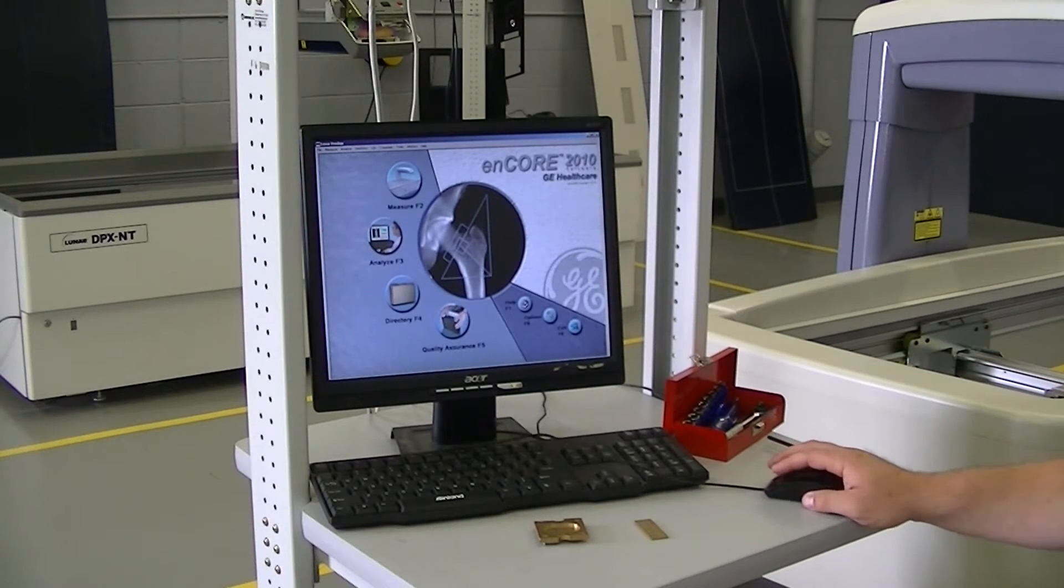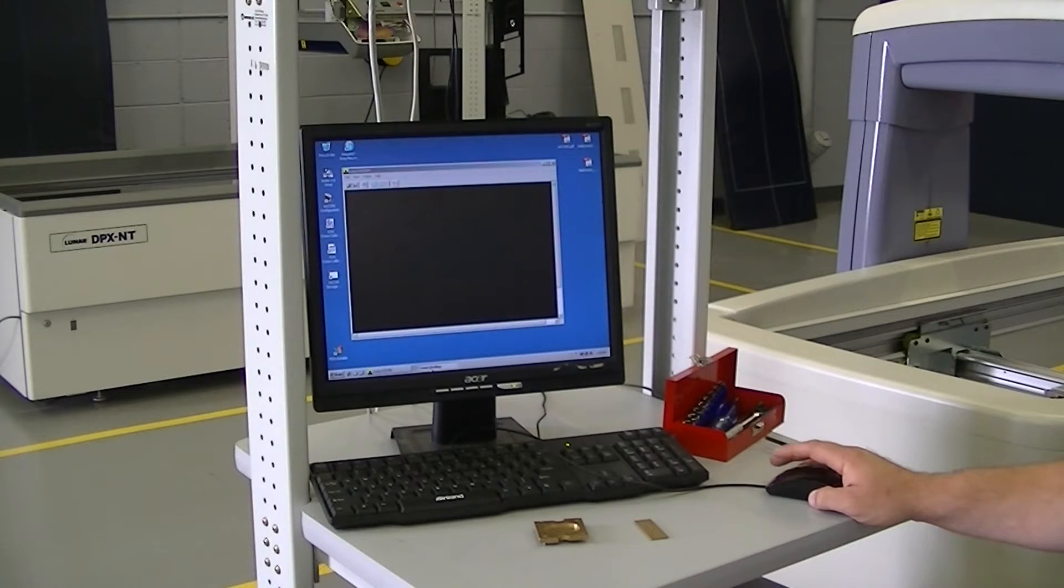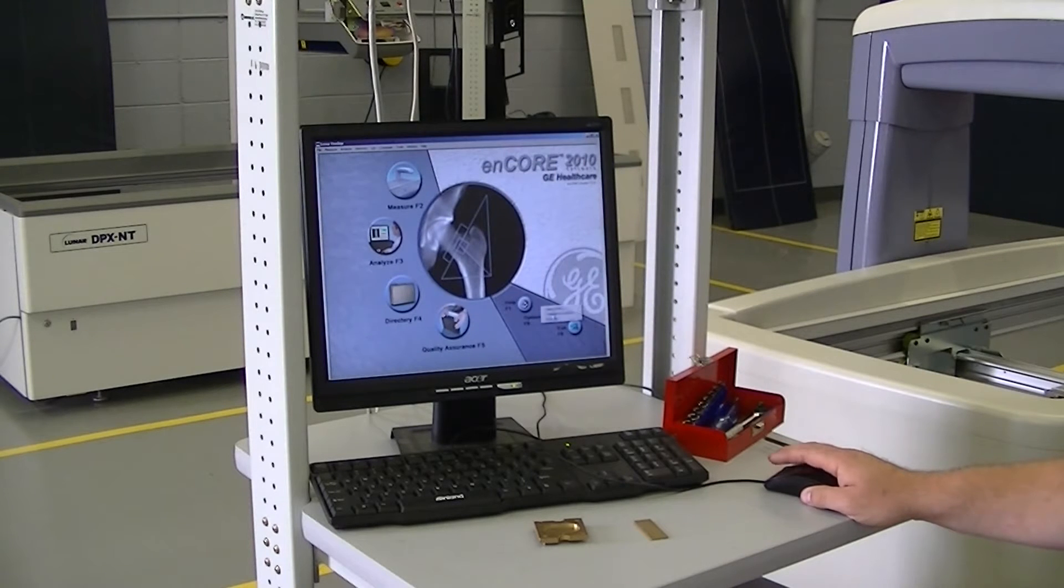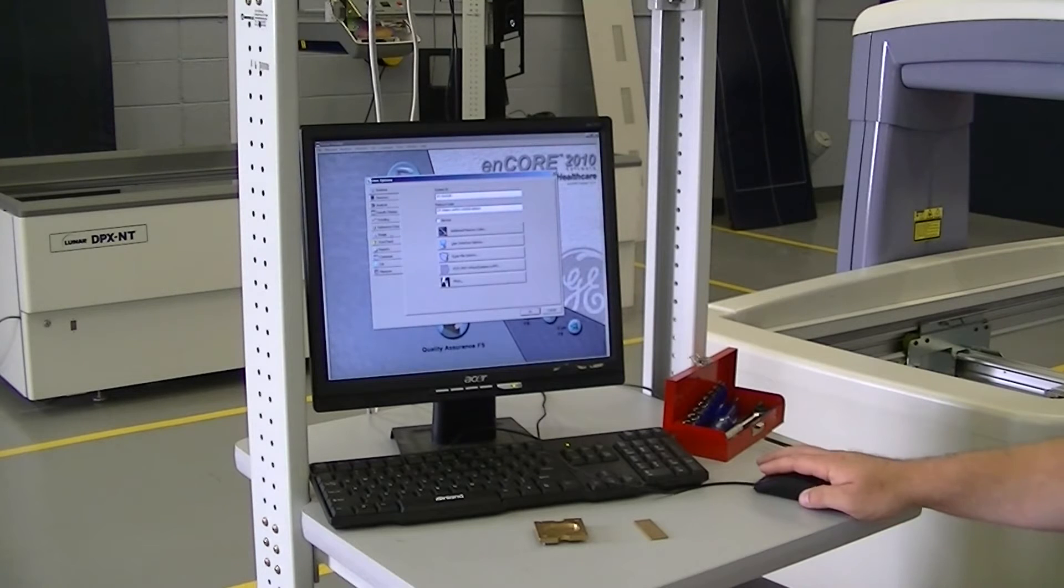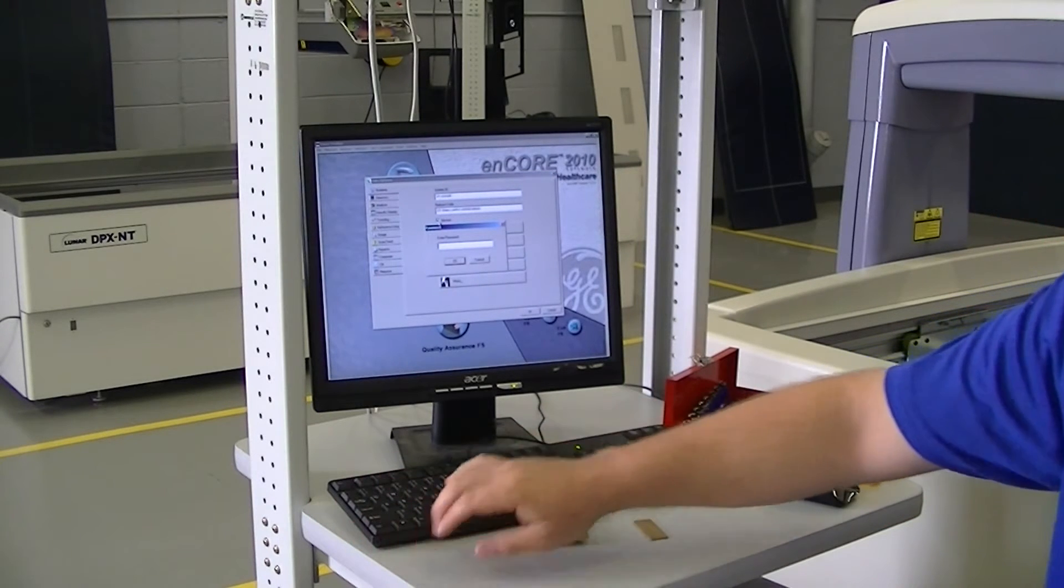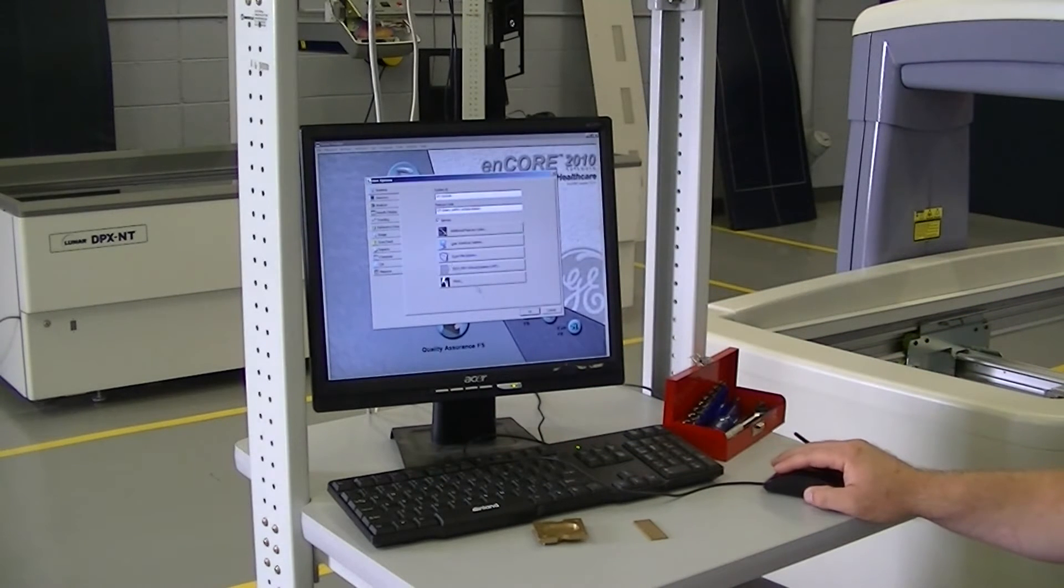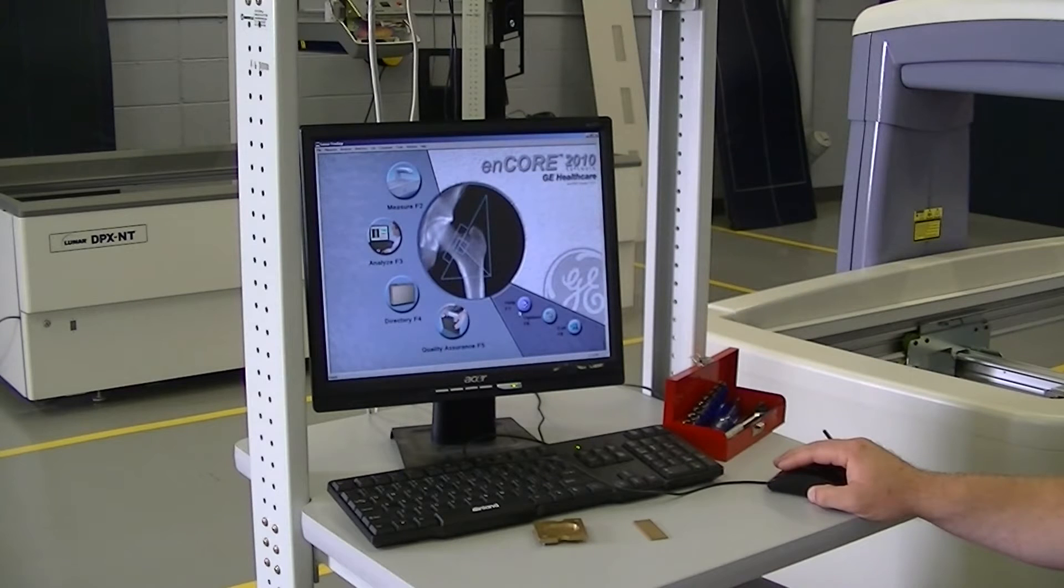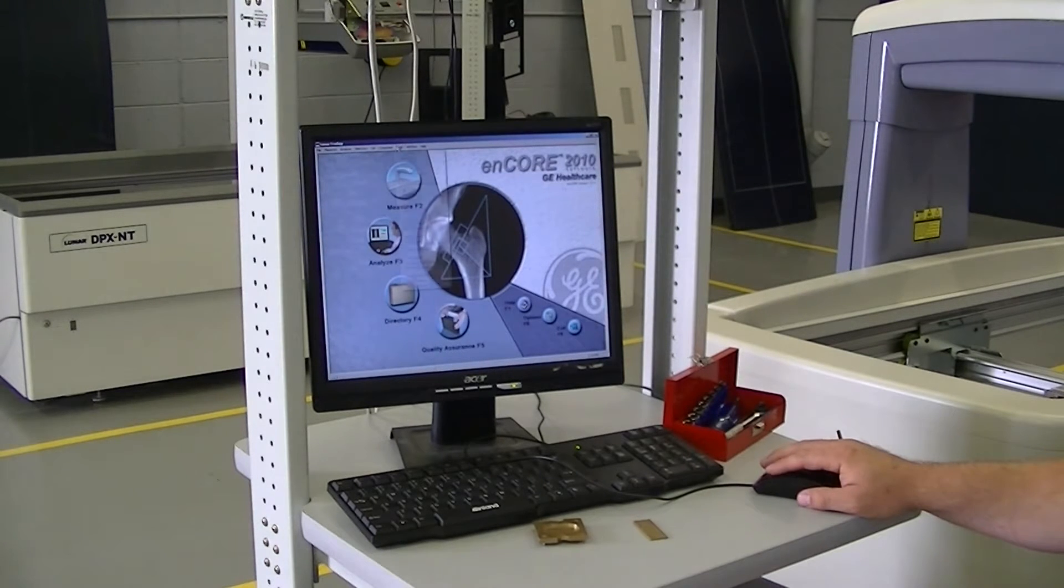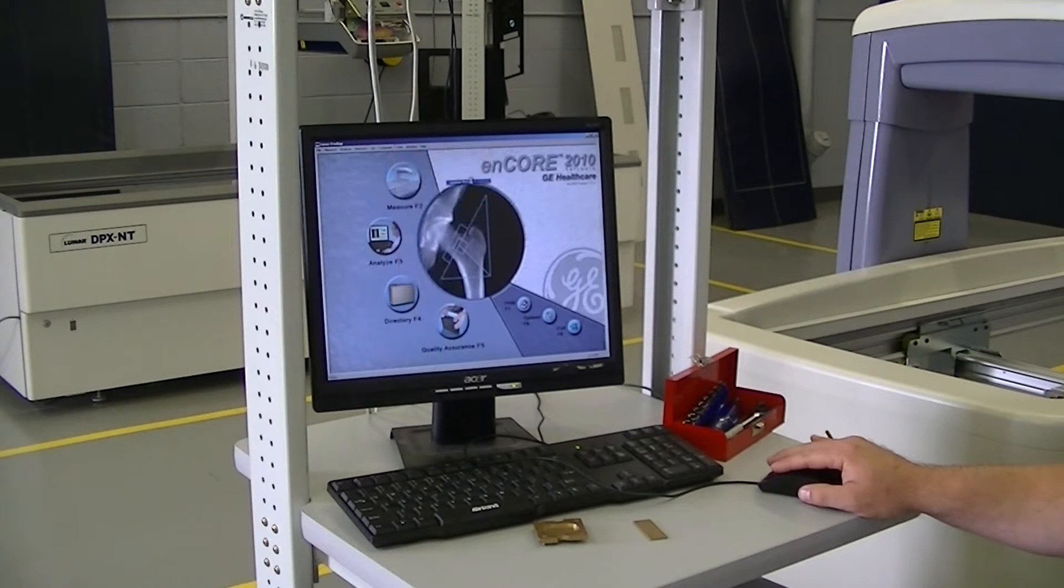The first thing you'll want to do is open the Encore software from the desktop. From here, go to Options, User Options, click on the Systems tab, and enable the service. You want to enter the password, which is 'badger'. Okay, now we are in service mode. From here, the first thing we're going to do is go to Tools, Diagnostics, Scanner Motion.